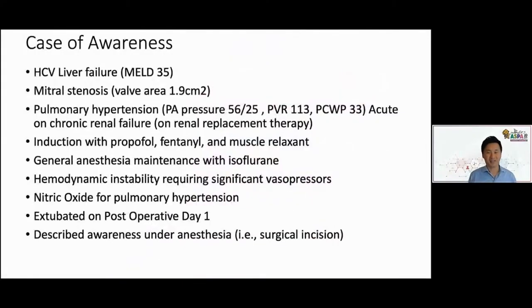All right, let's talk about a case of awareness. I think this is really important. Most of the cases I just showed you dealt with over sedation, right? And the cure for over sedation is less sedation. But if you take that too far, you'll get awareness, and I want to show you what that looks like.